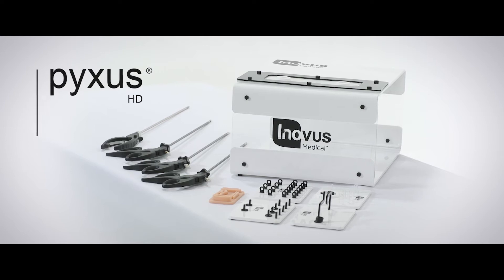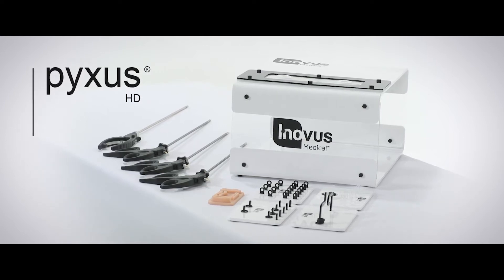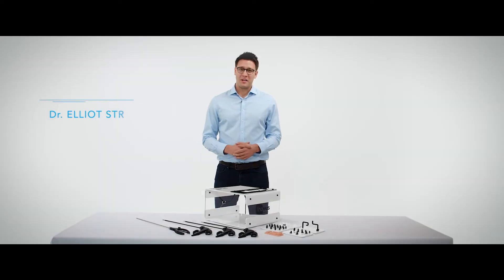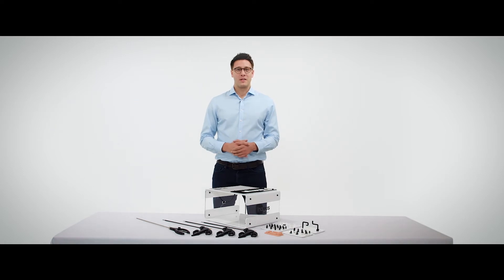This is the Pixis HD laparoscopic box trainer, our very first portable simulator for surgeons to practice laparoscopic skills from home. The simulator is completely flat pack and therefore extremely portable, and it comes with a number of products which allows you to carry on laparoscopic training straight out of the box.